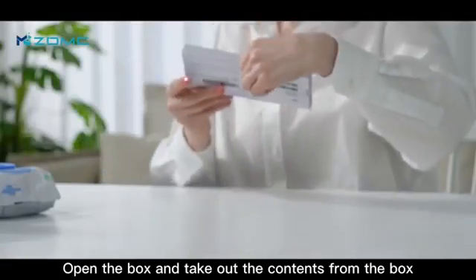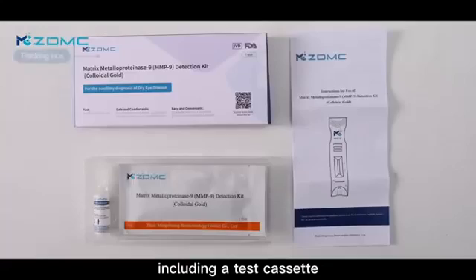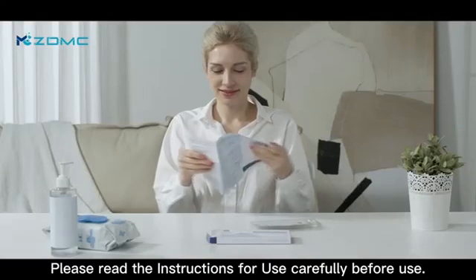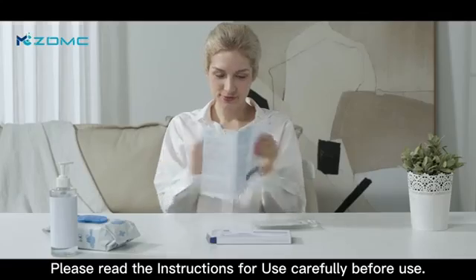Open the box and take out the contents, including a test cassette, a bottle of normal saline, and an instruction for use. Please read the instructions for use carefully before use.